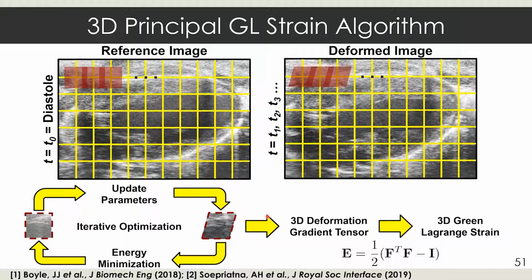Going back to some more questions here, do you think that a longer ischemia reperfusion time, let's say maybe 60 minutes of ischemia, would allow you to identify infarct sizes with your approach? Yes, I think that with a longer ischemia period before reperfusion, we definitely would be getting a lot larger infarct sizes.